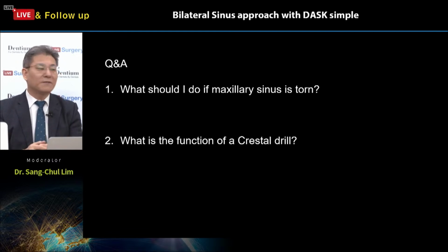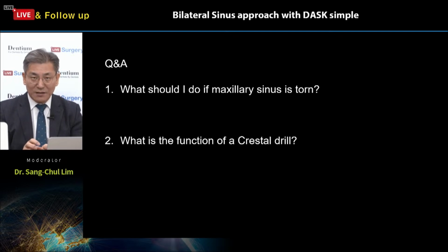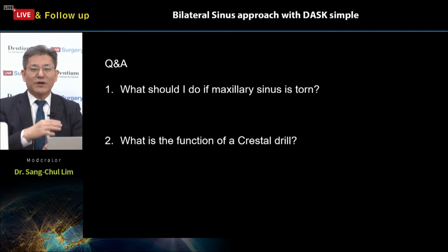That's it. Okay. And number 2, what is the function of the crestal drill? The crestal drill is a brand new item of the DASK Simple kit. The previous version, the original DASK kit, doesn't have this kind of instrument, right? The crestal drill and the graft spreader. This DASK Simple brand new kit has this crestal drill.